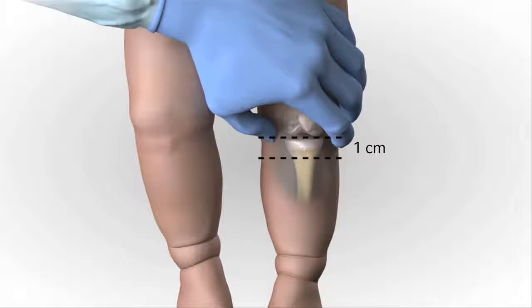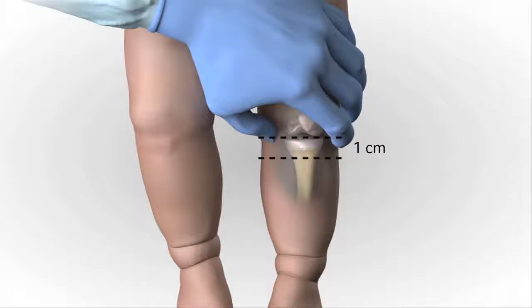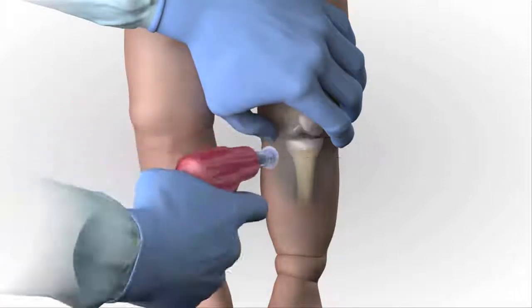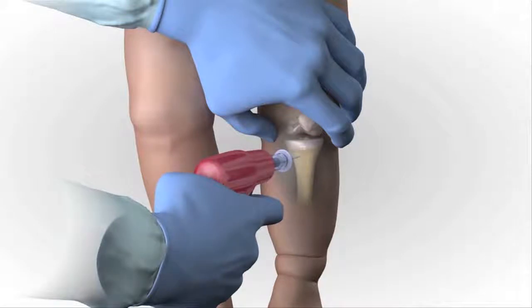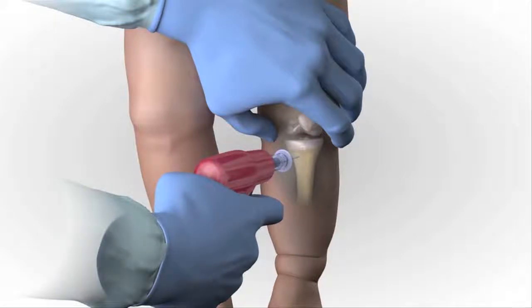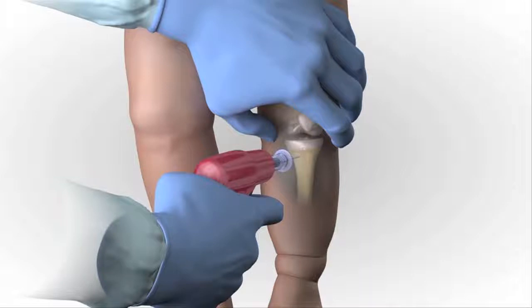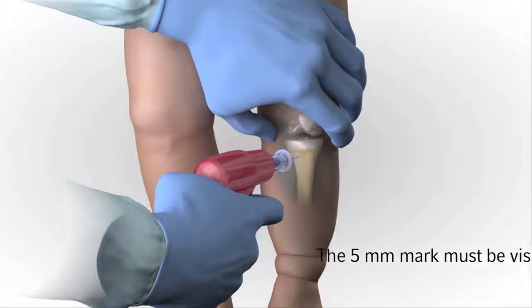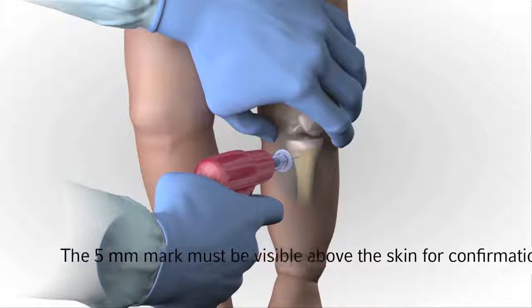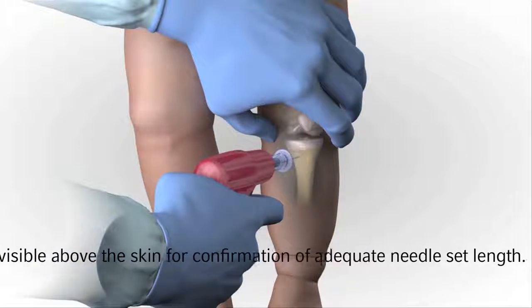Remove the needle set cap. Stabilize the extremity. Aim the needle set at a 90 degree angle to the center of the bone. Push the needle set tip through the skin until the tip rests against the bone. The 5 mm mark must be visible above the skin for confirmation of adequate needle set length prior to drilling.